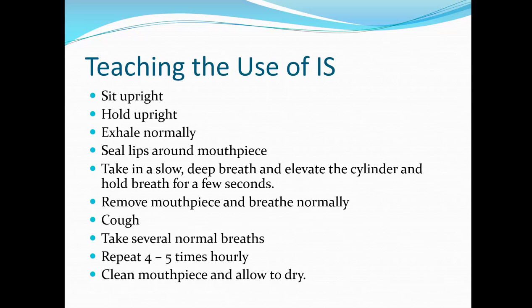And then after they've done that, they want to hold their breath for just a few seconds, 1 or 2 seconds, just so you're making sure they're getting that good, deep breath. And then they'll remove the mouthpiece and breathe normally. This is a great time to encourage coughing. So if it's loosened up any of those secretions, they can cough. Then take several normal breaths, and then repeat 4 to 5 times hourly.